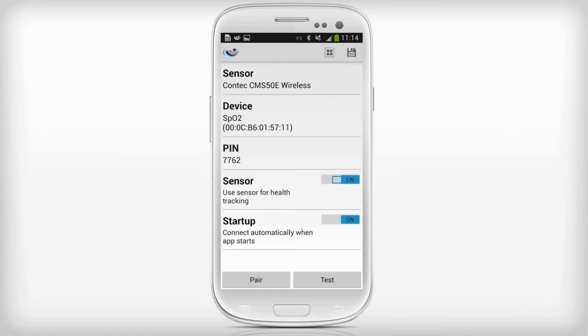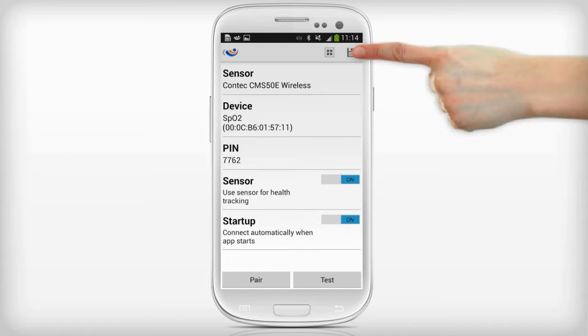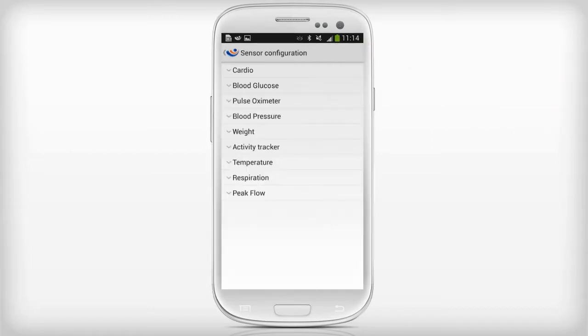Set sensor to on if you want to use this device. Set startup to on if you want MyFitness Companion to automatically connect to the device when it starts. Click on save to store the sensor configuration.